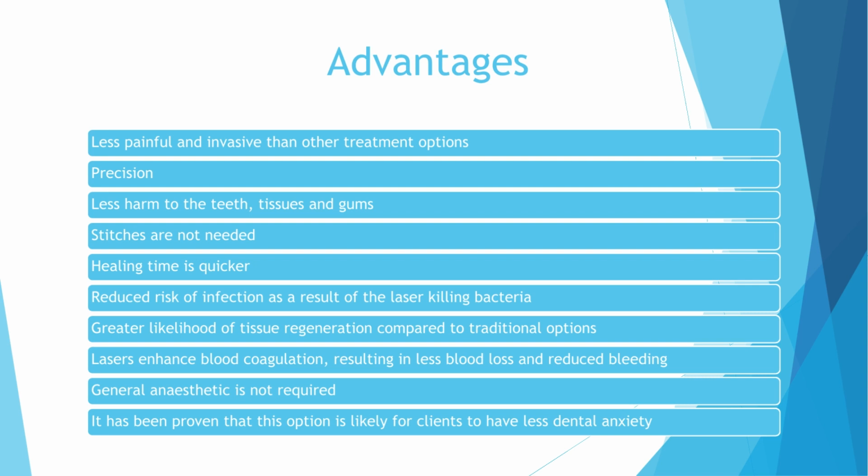Another advantage is that general anesthetic is not required. Overall, it's been proven that this option is likely for clients to have less dental anxiety, so that is a big advantage.